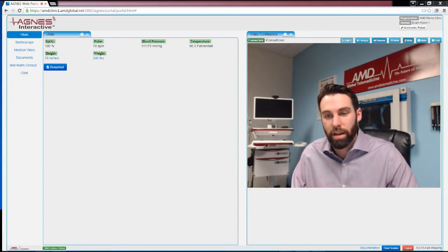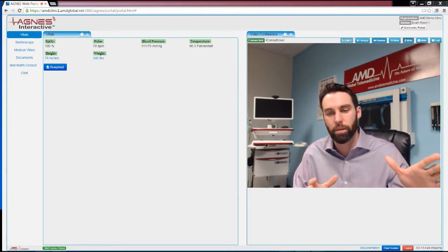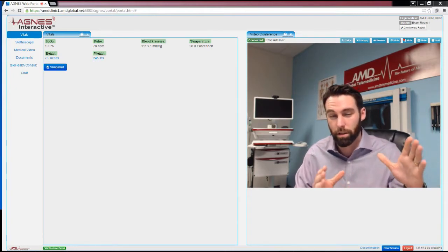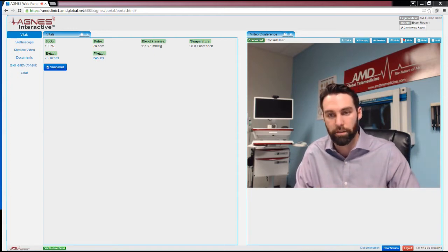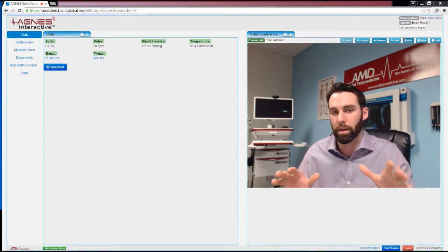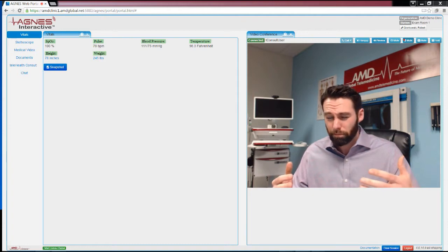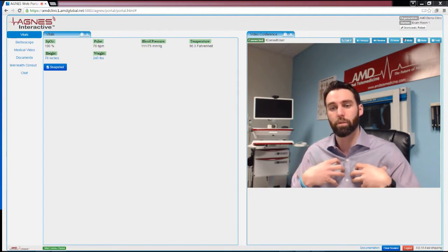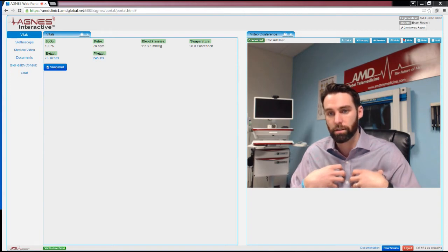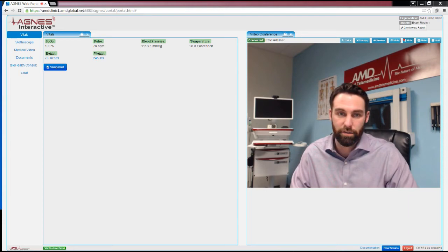So for the sake of the demo, we're going to skip the first couple of parts regarding the workflow and getting the patient to when they're prepared for the consult. We're going to focus on the live telemedicine encounter. Here we are approaching it from, I'm playing the role of both the patient and the nurse, and you're viewing it from the side of the doctor.